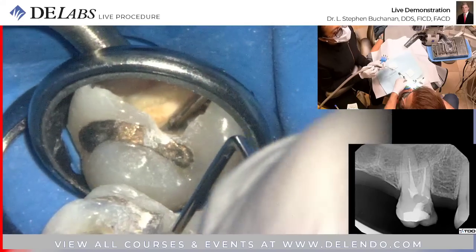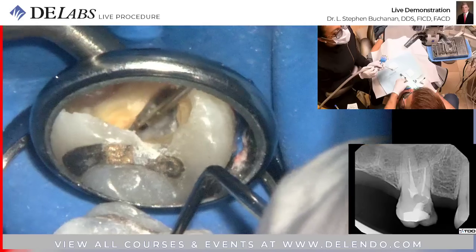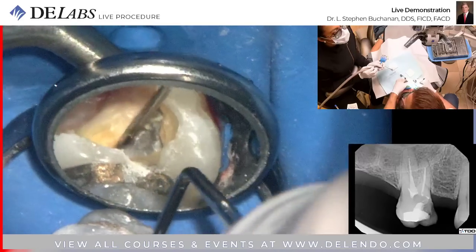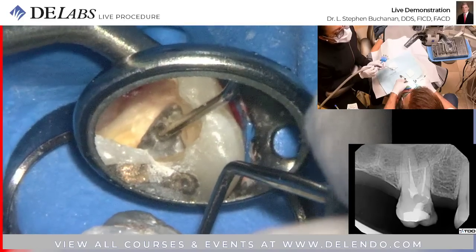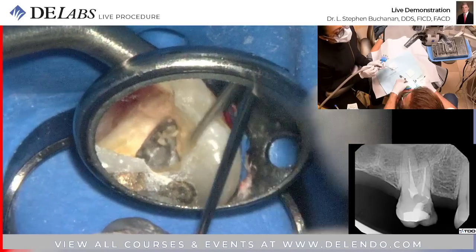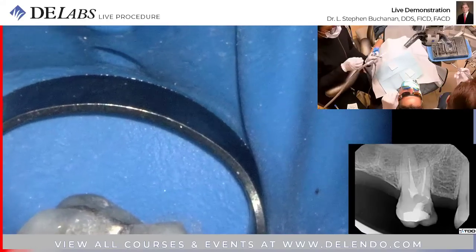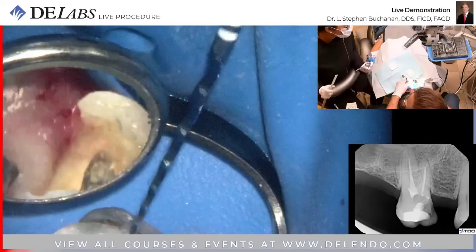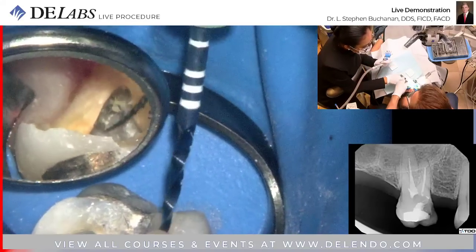I have awesome tug back there. All these mesial canals are coming in at almost a 90-degree angle. Without an angled explorer, you're going to have a hard time finding a lot of them. So if you have a DG16, just put a bend on the very end of them. For now, I'm going to see if a rotary file wants to go in there. This is so much easier than putting your whole hand back there and trying to see around it.